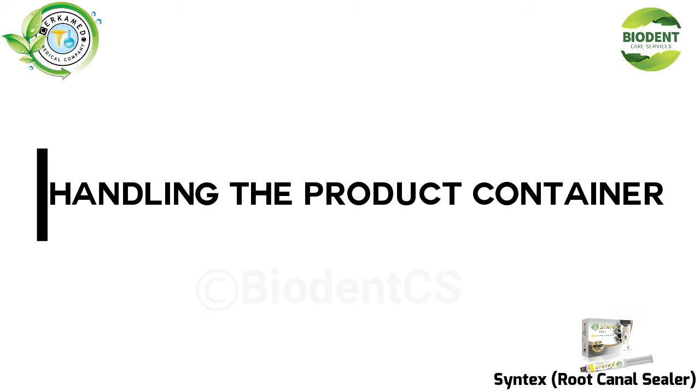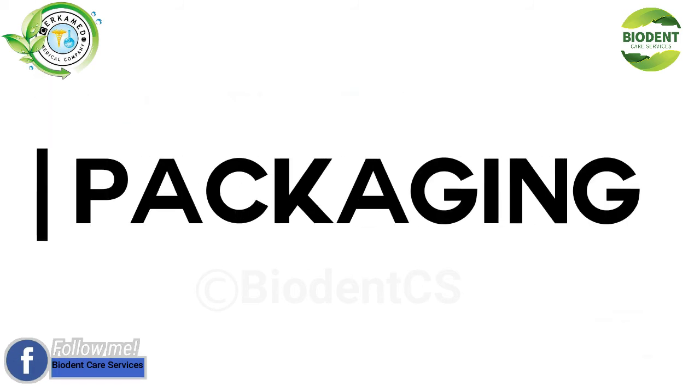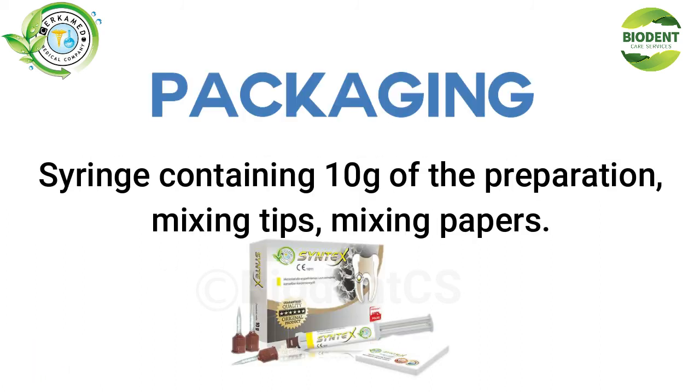Handling the product container: Empty containers should be disposed of responsibly or returned to the manufacturer. Packaging includes a syringe containing 10g of the preparation, mixing tips, and mixing papers.